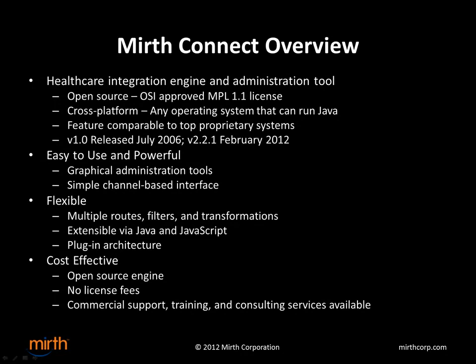And we also have a plugin architecture where you could create your own extensions, connectors, mapper tools, and plug them into Mirth Connect. Mirth Connect, obviously because it's open source, is also very cost effective. Since Mirth Connect is open source, we have no license fees at all, and instead we offer, as a company, Mirth Corporation, commercial support, training, and consulting services.